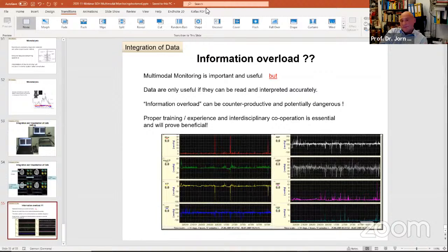If you have a localized problem like an infarct, of course, you shouldn't put the PO2 probe into the infarct, and you should actually put it not in the normal tissue, but in the tissue that's basically at risk of damage. So let's say there's a right frontal infarct or bleeding and/or contusion, and you put the probe behind that, because what you don't want is that infarct to increase. Then you can use that probe to do this measurement. So you have to be very selective where you put the probe.